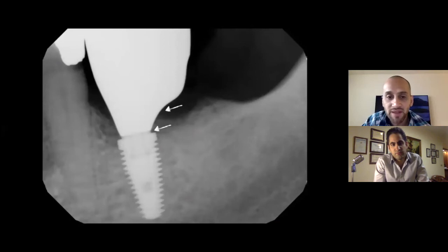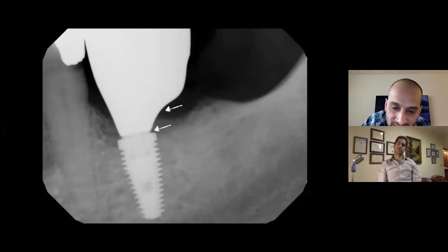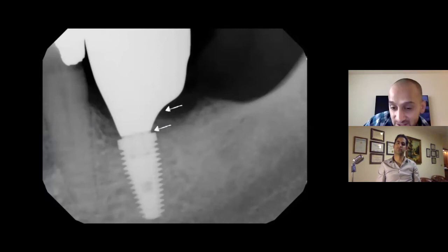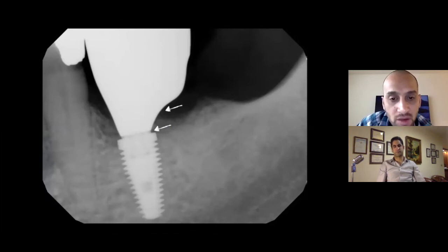And here's another example of a tie base. So that little sliver of titanium that you see, that's 0.6 millimeters of thickness of the tie base. And the second arrow you see on top of that, that is all polished zirconia. And look at that bone level. Look at that soft tissue barrier. So all of that soft tissue is lined up by fully monolithic polished zirconia. And the tie base gives us a pristine 2 micron fit, clamped in by the prosthetic screw, torqued to 45 newton centimeters of torque, and that implant is stable.